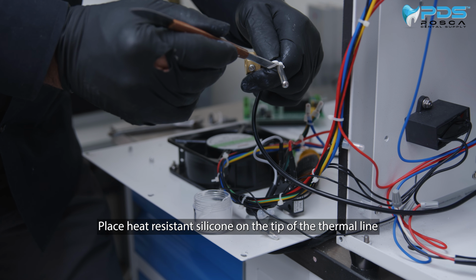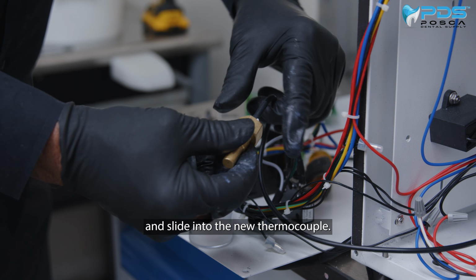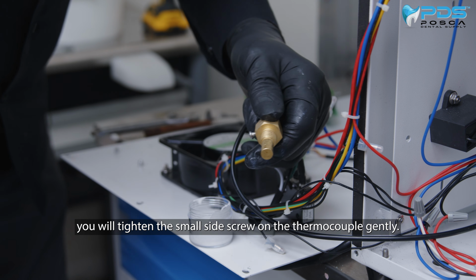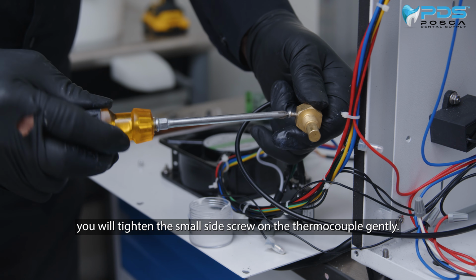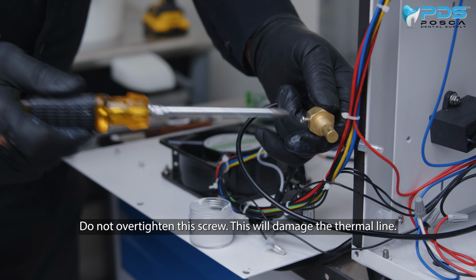Place heat-resistant silicone on the tip of the thermal line and slide into the new thermocouple. Once inserted, you will tighten the small side screw on the thermocouple gently. Do not over-tighten this screw. This will damage the thermal line.